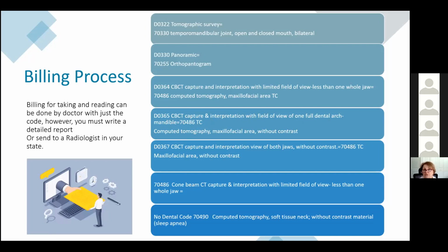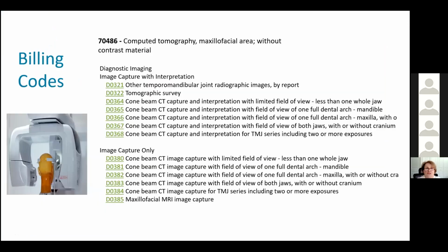So if you took a film and you're not interpreting it, you're only supplying the component of the scan so it can be read. You're going to use two different diagnostic codes, but the dental world has really made it more confusing because you have two separate codes altogether.